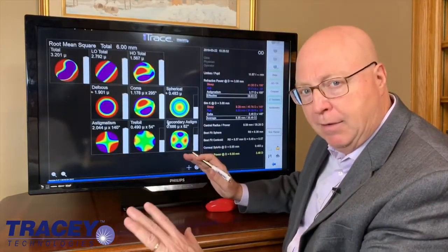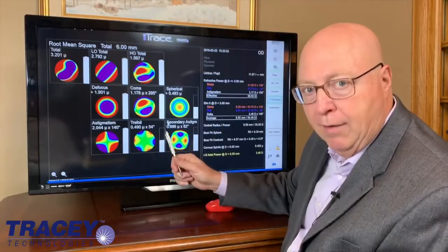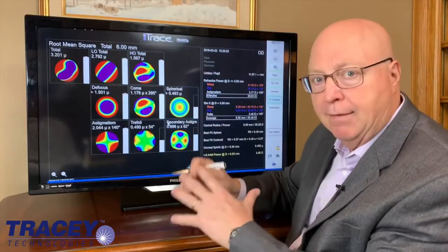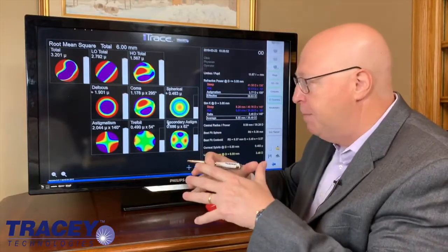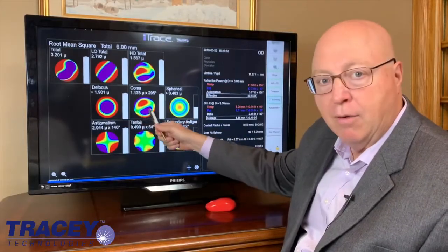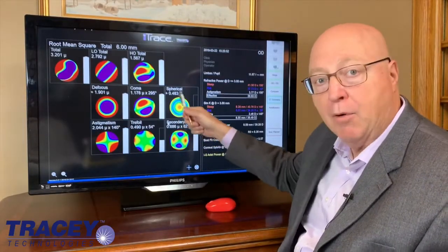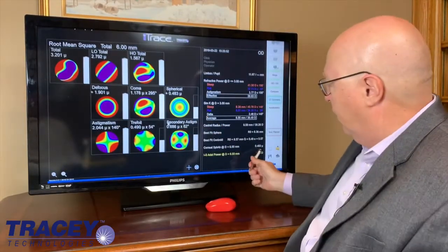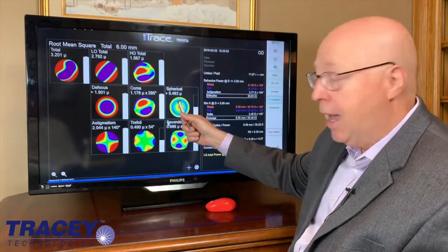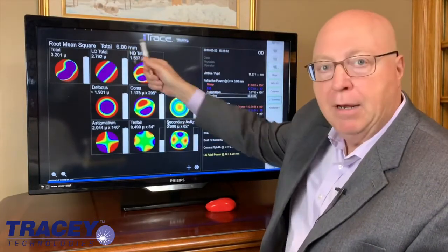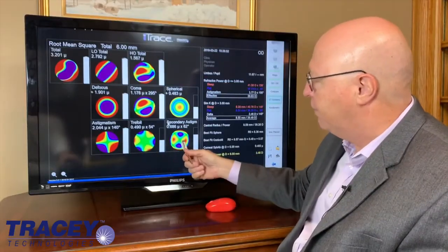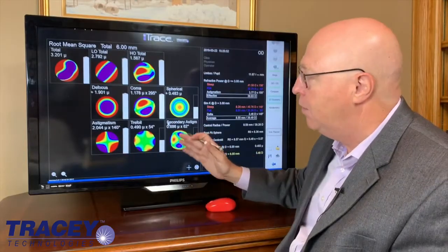This is a very busy display, but this is corneal information. Each of these buckets is a type of aberration — all the coma would be put together in one bucket. All the spherical aberration, which you can see is 0.483. That's pretty high. That's what we say at six millimeters of cornea. There's the trefoil, the secondary astigmatism, the astigmatism. You can see she has a lot of corneal issues.